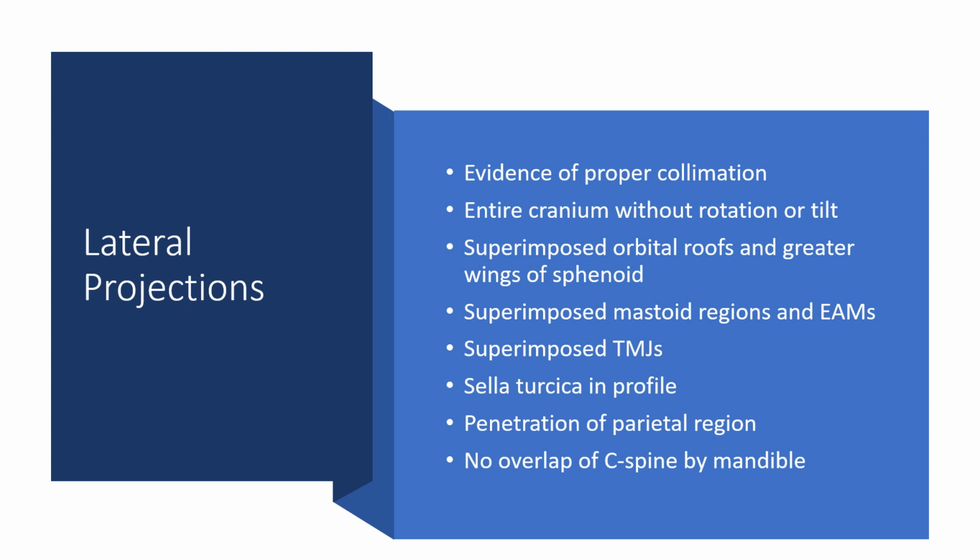I'm glad I checked that because I almost misled you. Okay, very good. IOML horizontal, interpupillary line intersecting your image receptor at a perpendicular, mid-sagittal plane parallel to your image receptor. And then the patient's head will be properly positioned. Center 2 inches superior to the EAM.